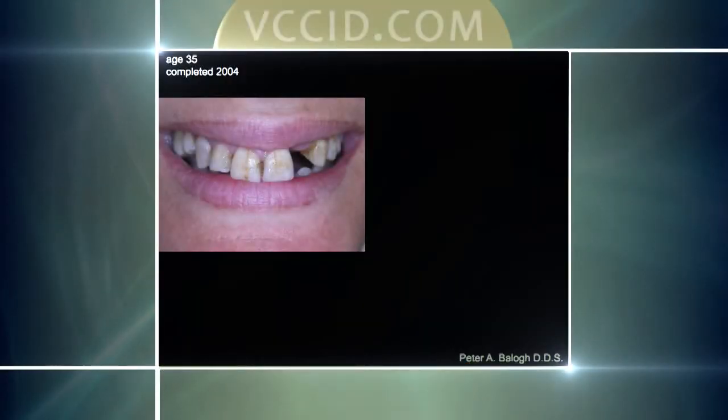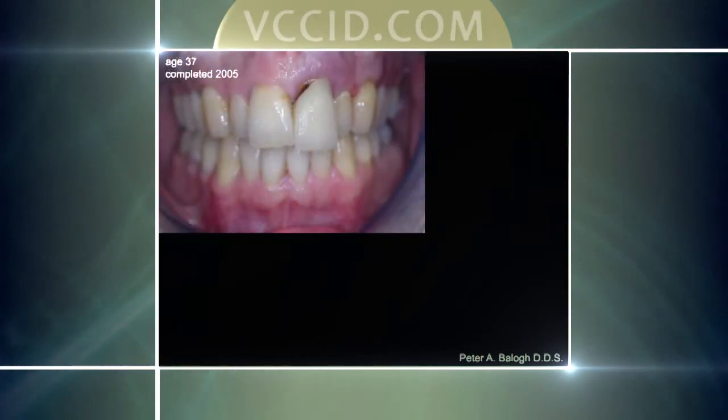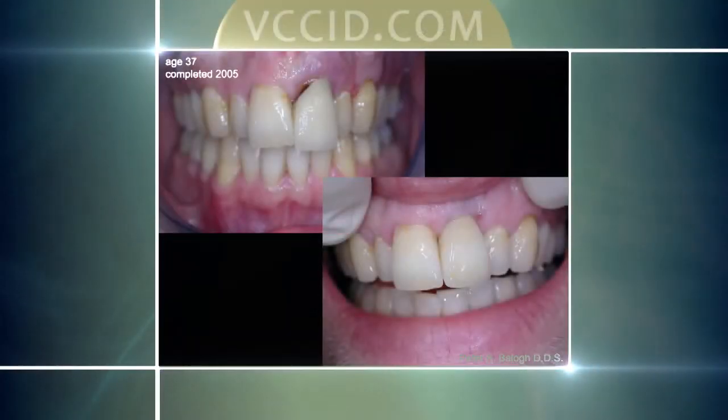That implant and crown is still in place and functioning very well. Another one showing a single tooth missing where we did not only implant work but also cosmetic work — porcelain veneers on the natural teeth. Another one: this is Jerry, who came in with a front tooth that was fractured. We checked how it had healed, took the temporary off, and made him the final tooth that you see on your screen.